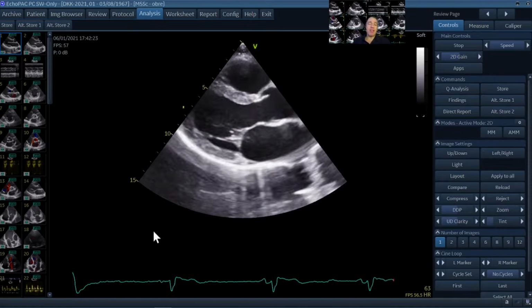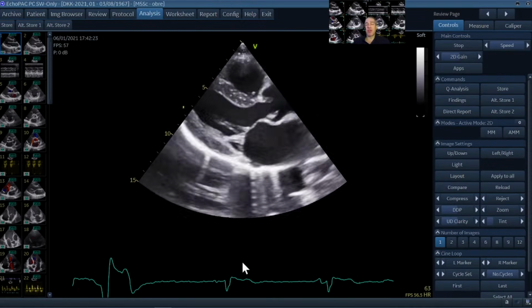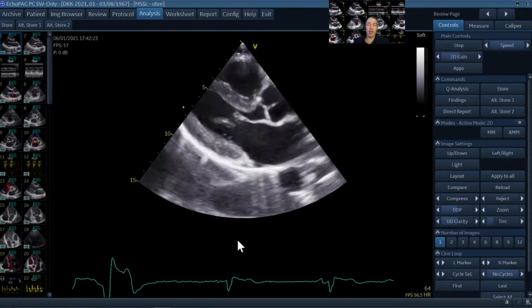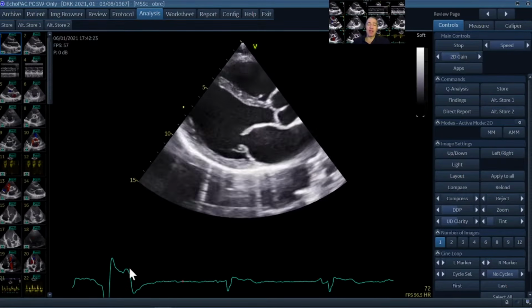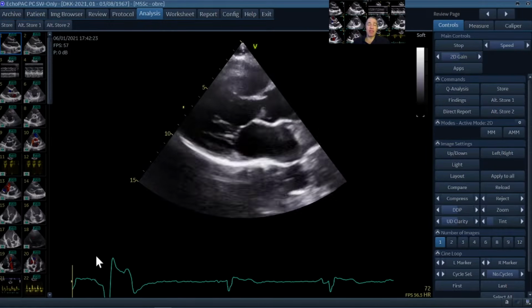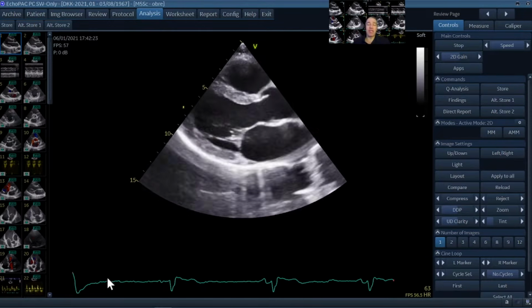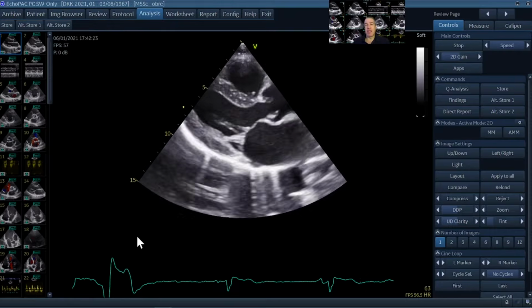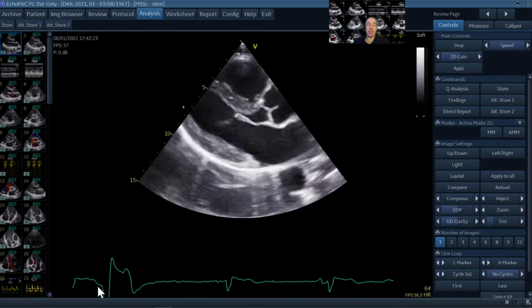Now please notice that we have recorded several heartbeats in a row, so not only one. You might also record only one good heartbeat. This longer cycle here starts with a ventricular premature beat with the extrasystole. And I can tell you in this woman on the ECG, this looked like outflow tract extrasystole, which is a common benign variant of ventricular premature beats.